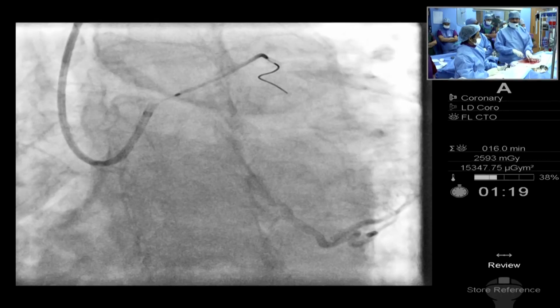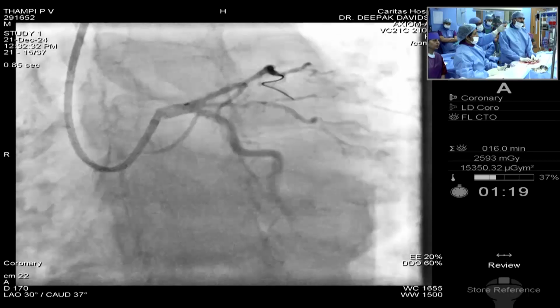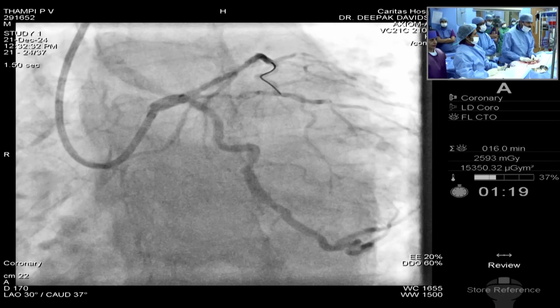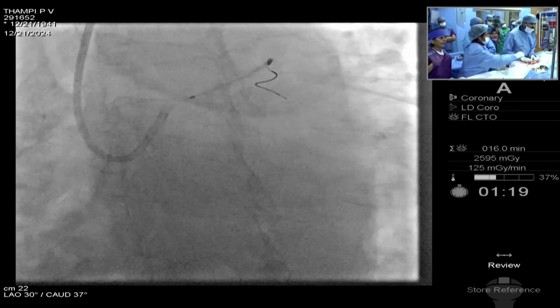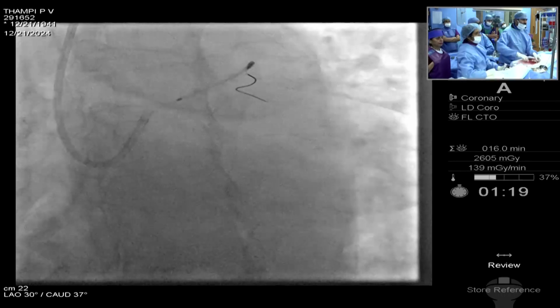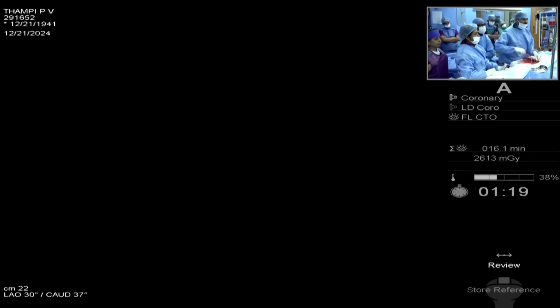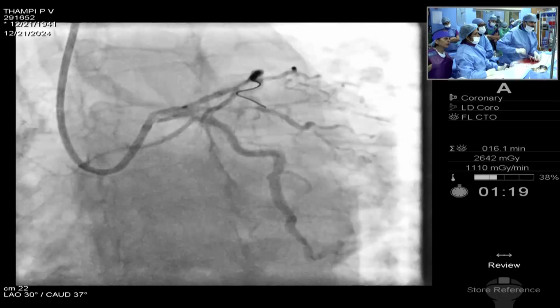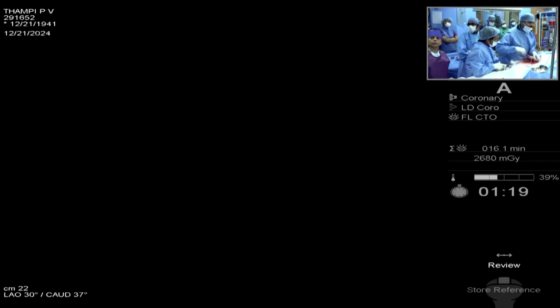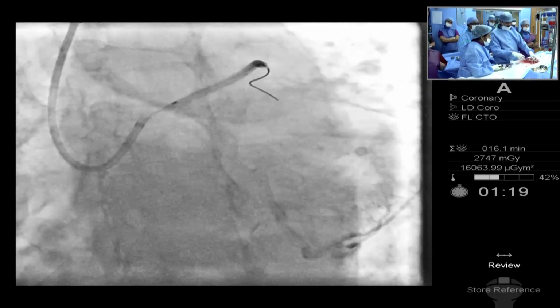Should we go 1 mm distal? Because it's actually more like an early diagonal, maybe 1 more millimeter distal. Looks reasonable. Okay, there probably we can post. Okay, we'll go up. Anyway, we'll go up. Okay, so now 3, 2.75, and finally 8. Yes. 10.